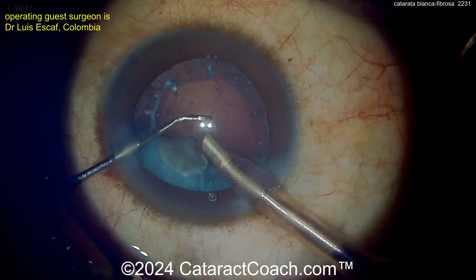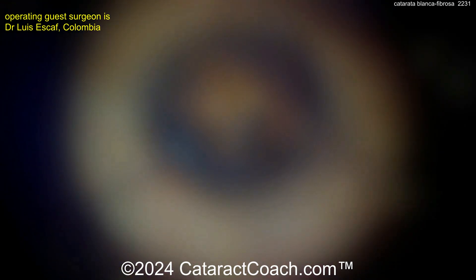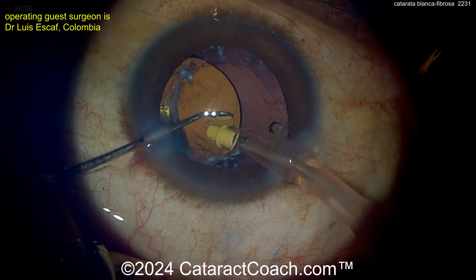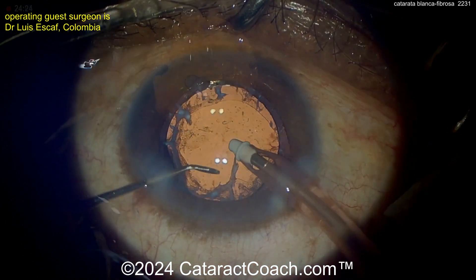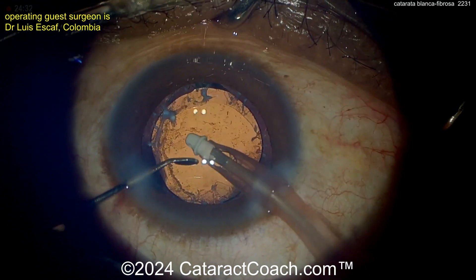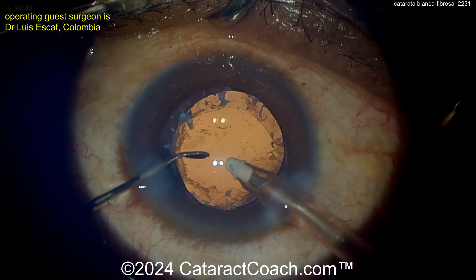We've even seen videos on Cataract Coach where you get little calcifications — little rocks inside the eye. These fibrotic things you may not be able to free all of them, and that's okay. Here's the lens going in the eye behind, removing viscoelastic, and clean up as much as you can. There's a balance here — think about what visual acuity the patient had before surgery; it was pretty poor. Taking your time, be gentle to remove as much of that material as you can. It can cause some inflammation in the post-op period, but there's just no way of getting this capsule perfectly clear.